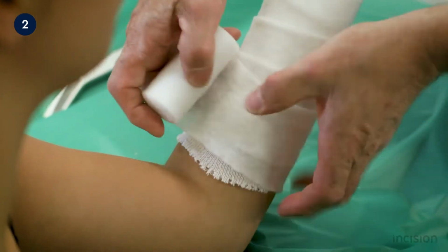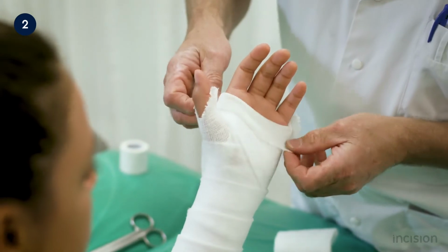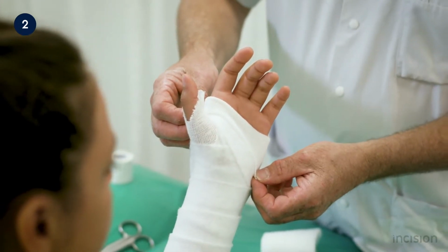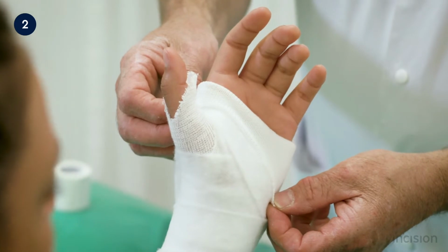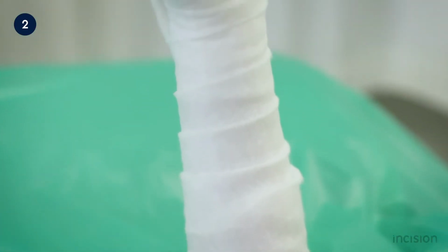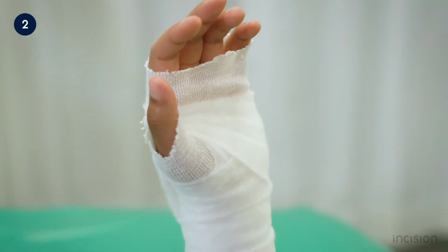Note that the stockinette is left longer than the padding distally and proximally. Care should be taken not to immobilize the metacarpophalangeal joints. Therefore, the folded edge of the stockinette should be located proximal to these joints, as shown here. It is advised to check if there are no uncovered areas left. This should be avoided to limit the risk of thermal injury of the skin.